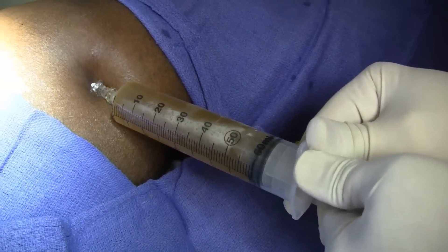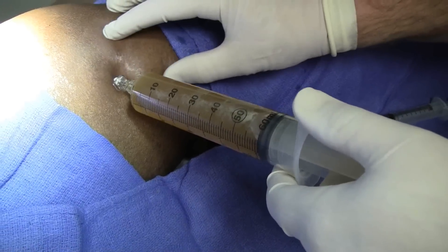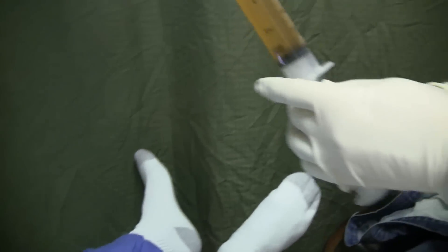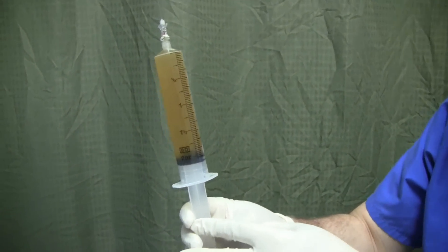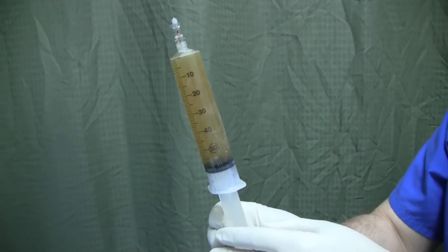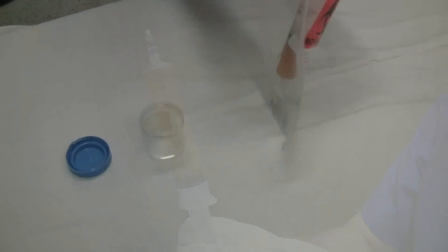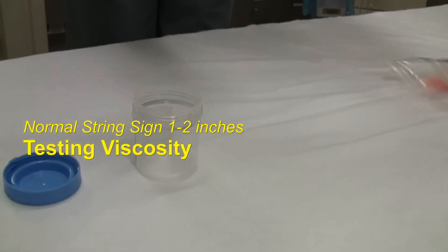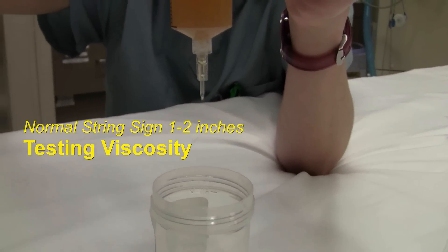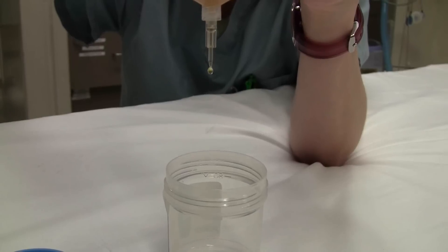That is a lot of fluid — I'm at 60 ml, I'm going to stop right there and pull back. Look at all that fluid — 60 ml right there, and there's more in there — but this is enough for diagnostic testing. That's probably where all that pain was coming from. We're going to demonstrate the string sign now — let's see how long this strings out. There's hardly any string whatsoever on that.